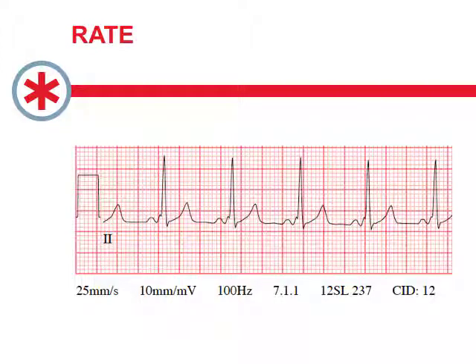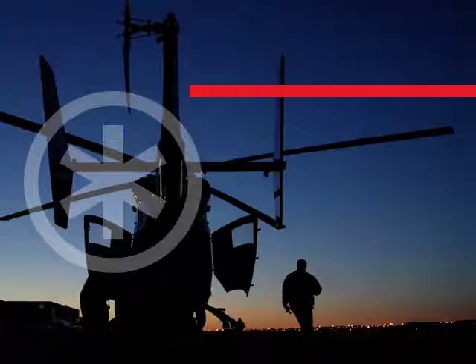So if we want to wrap it up, why don't I get you to pause this video for a moment and calculate what the heart rate is based on the first sets of QRS on this ECG strip. And now if you're back from pause, that rate is about 88 beats per minute. Basically, you have 17 millimeters between the QRSs, and using our formula, that's going to give you 88 beats per minute. So that's it. Quick and dirty way to go for rate.